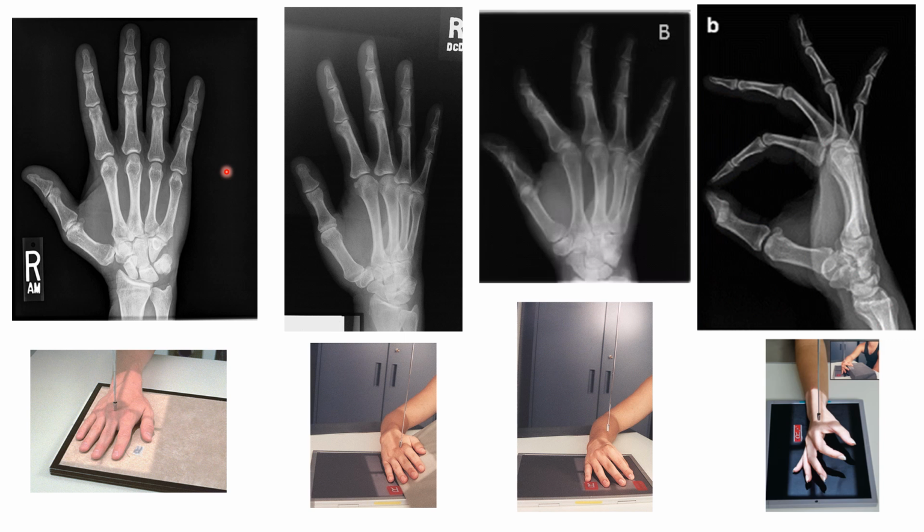So we want the long axis of the hand placed parallel to the IR. The center ray for all of our routine hand x-rays would be perpendicular. For our PA hand, it will be at the third metacarpophalangeal joint, the third MCP.